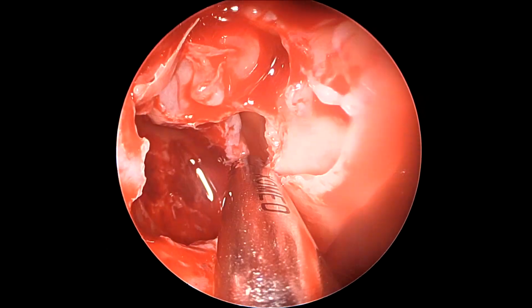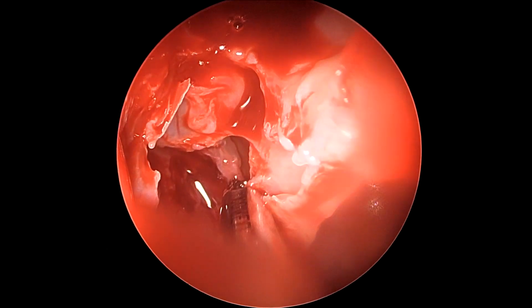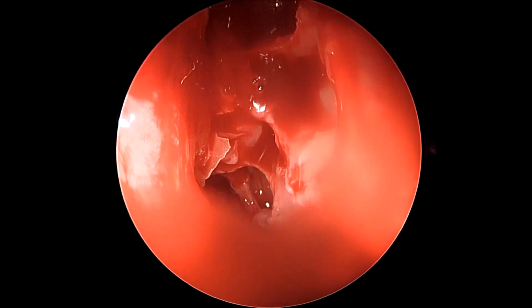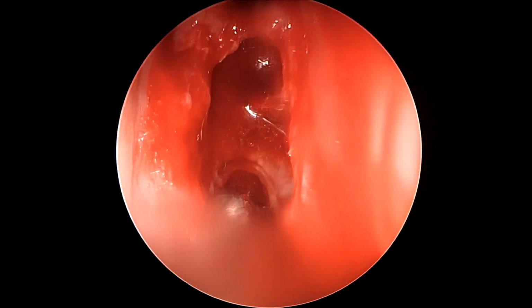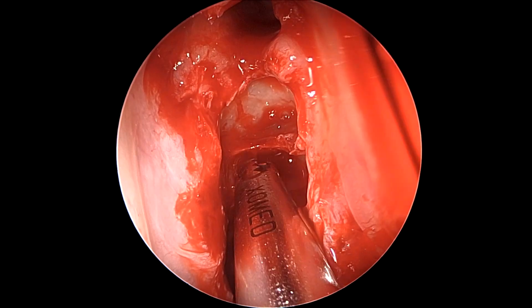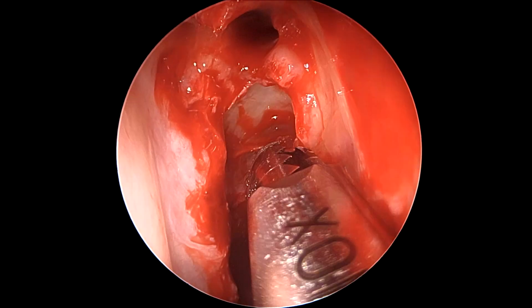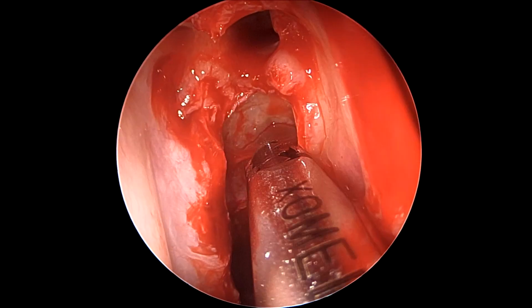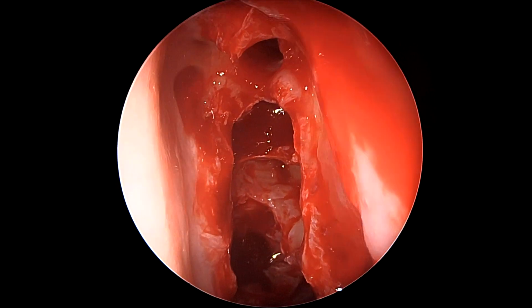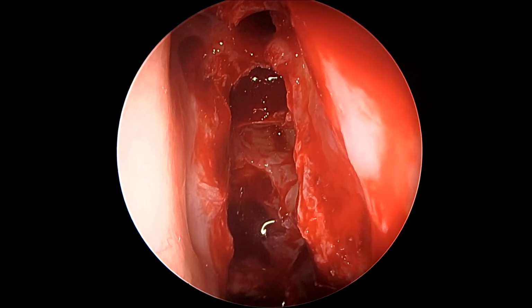Now, as you see here, how important it is to dissect all the ethmoidal cells and not leave any recesses behind, because they could be the site of not only recurrent polyp formation as well as new bone formation with new osteogenesis, which can be quite vascular and troublesome in the future. As we see here, the frontal recess and the anterior ethmoidectomy is quite good. The fovea is very clearly visible and minimal septations.